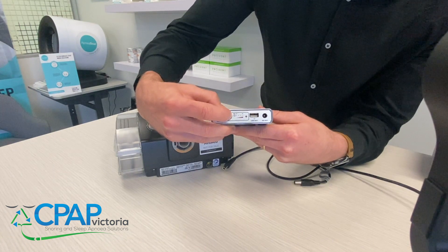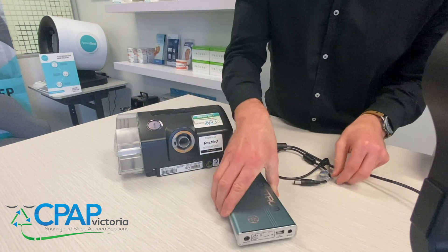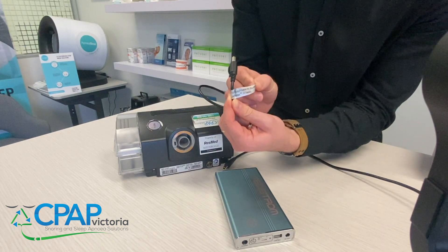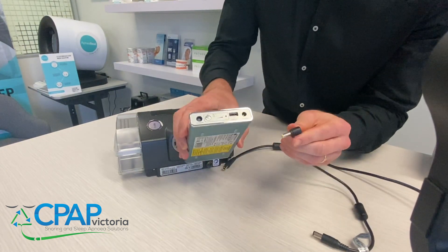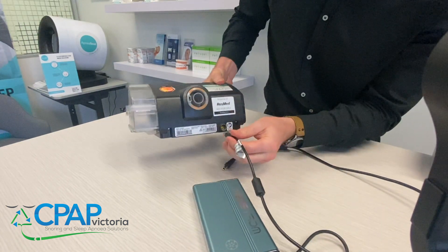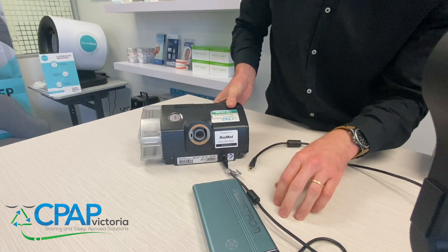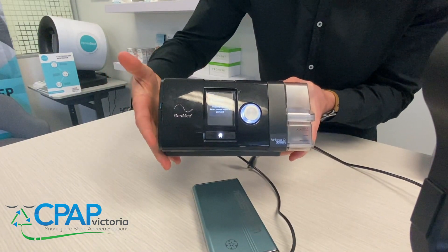Now in order to run this battery as your primary power source for your S10, you're going to need to grab the DC output cable, which is labelled and inside the box. Plug the DC output end into the DC port, then plug it into the back of your machine. It'll turn your device on and you should be ready to go.